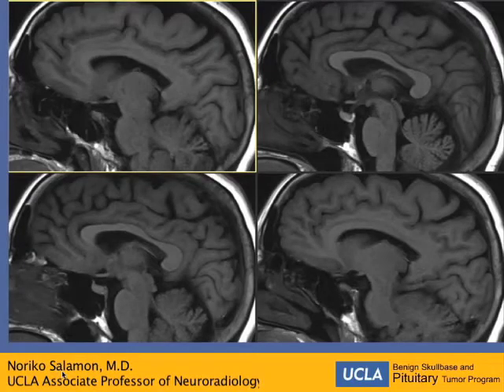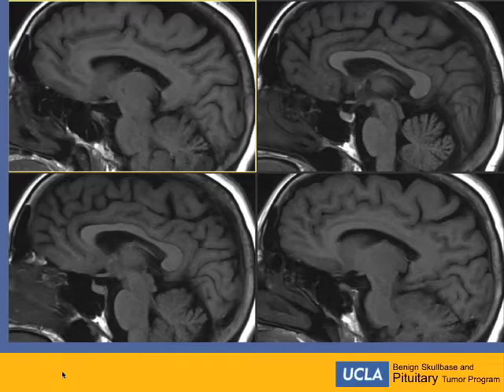In the case of Cushing disease, when the outside study was read as normal, we do a very careful exploration. We use a dynamic study, of course, and then we use thinner cuts, and we can also count on sometimes heavily weighted T2 weighted imaging or high resolution T2 weighted imaging.